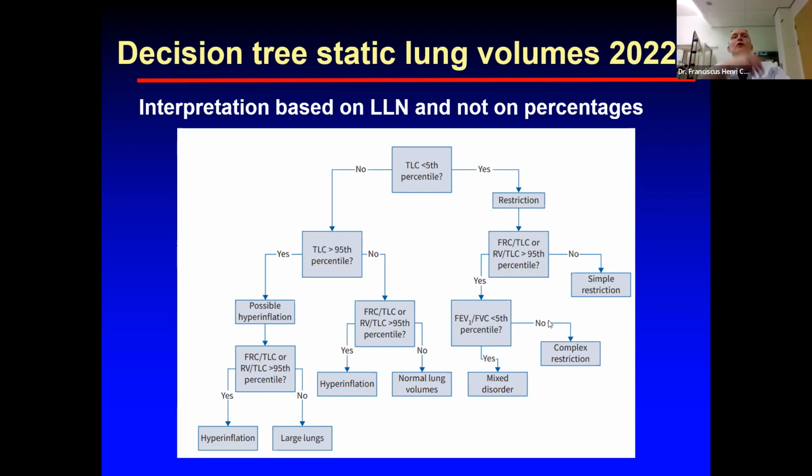Now, we normally always do the same day, but we have a small handheld and it's a small finger prick at the side. Indeed, you can go up to several days if you have a disease which does not influence your hemoglobin. But some of these diseases, or the patient gets packed cells or whatever, so if you have the suspicion that hemoglobin could have changed after the last measurement of it, you should do the measurement again.